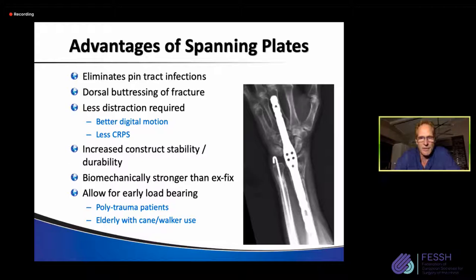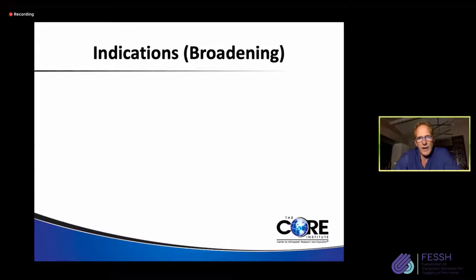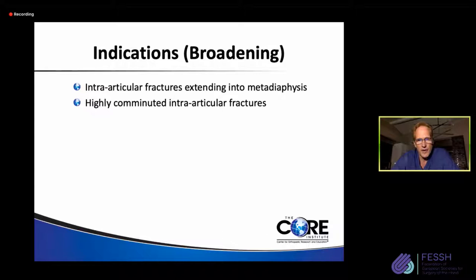Now, the indications for spanning plates initially were intra-articular fractures extending to the metadiaphysis. Also, these highly comminuted intra-articular fractures were obvious indications to replace the X-fix. But now the indications seem to be broadening, at least in our minds in North America, to include osteoporotic bone where we can neutralize the forces with the spanning technique. Far distal fractures, the type you see in the elderly, are difficult to control with any kind of fragment-specific fixation.